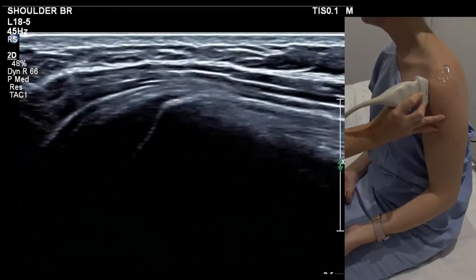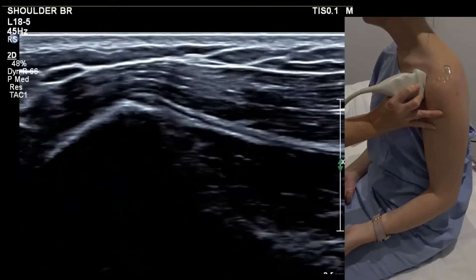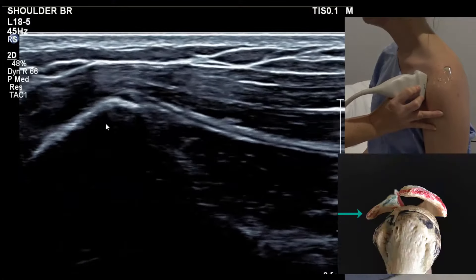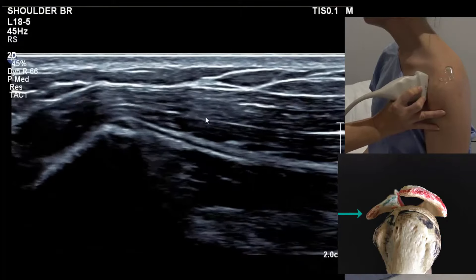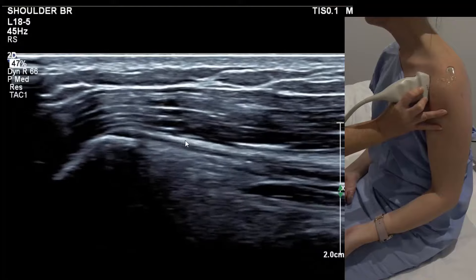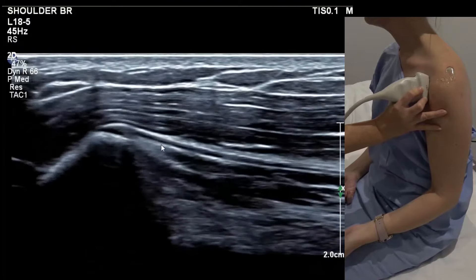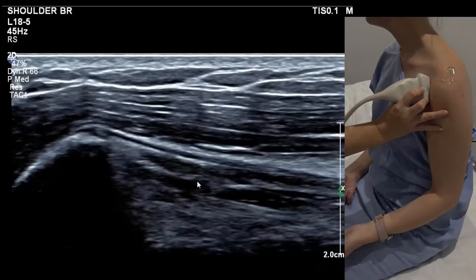If we keep our probe in long and slide across medially, we eventually run into the coracoid bone. This skinny little tendon here is the short head of the biceps. You don't routinely have to image that, but it's very helpful if the long head is ruptured to tell them the short head is intact. The muscular belly underneath is coracobrachialis.